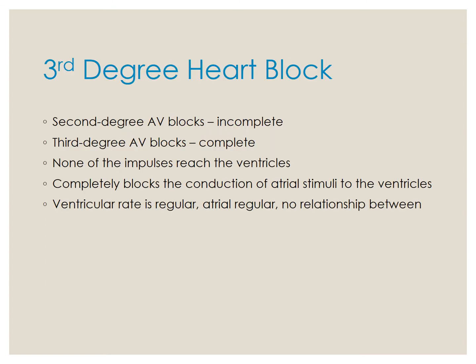All right, our last type of block is our 3rd-degree AV block. So 2nd-degree AV blocks are incomplete. For some reason there's a delay in something on there, but it's not a true block because we are still getting conduction through the heart. 3rd-degree AV blocks are actually complete heart blocks. Okay, these are bad. We do not want to have these.